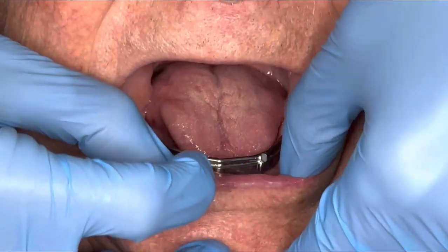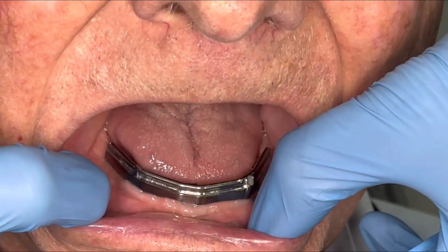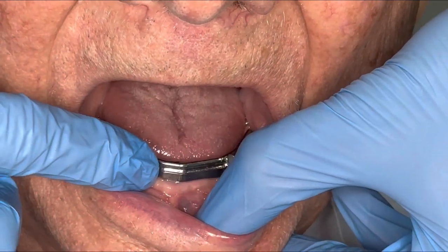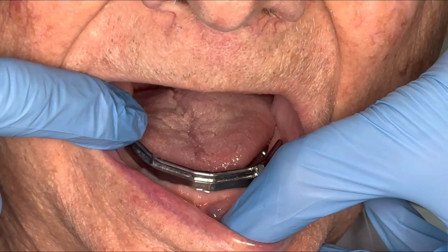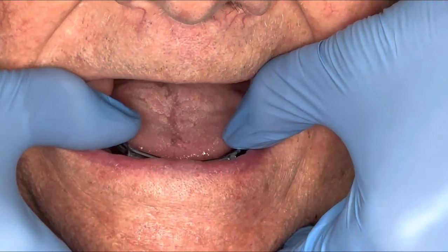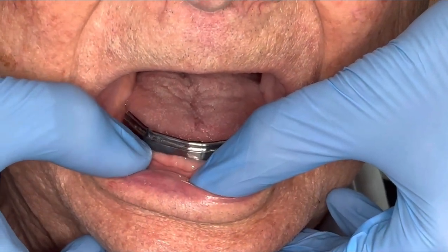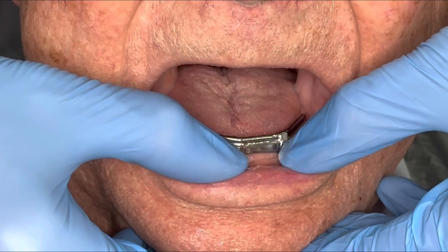And then open for me. And then on the lower here, this is a custom designed titanium bar tying together three implants. And that bar really works well. It splints the implants together, gives us a nice precise connection for our clips. And another nice benefit of it is it raises the connection up off the tissue more so than like an individual clips, kind of like a locator or a snap type connector.